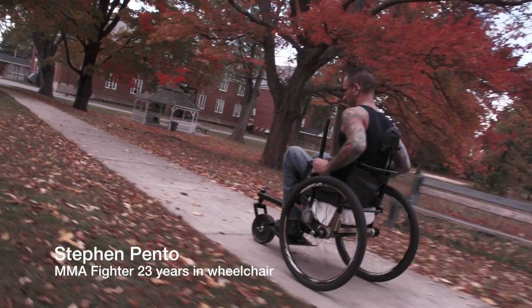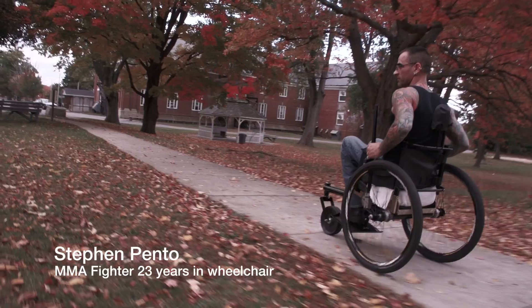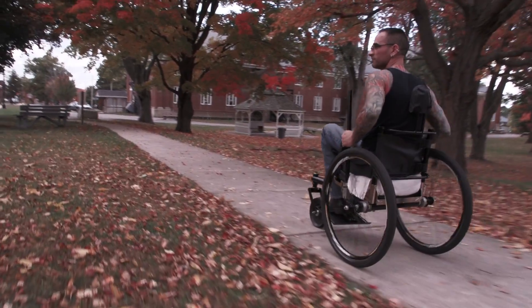Even he worked up a sweat running after me. So it's definitely much better. And as far as getting out and having a good time going off-roading, this is much better. This is great.